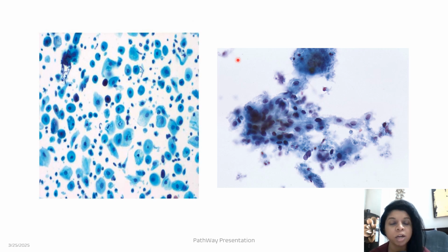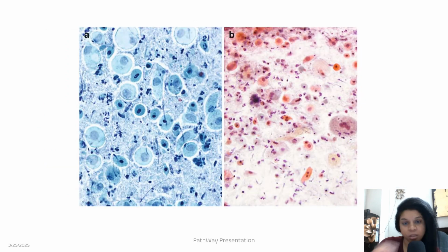And in the background, at times you can get granular debris, which is common in an atrophic smear, because the cell is disintegrating or atrophic. You may confuse this debris for tumor diathesis. Already the parabasal cell layer looks like it has a high NC ratio. Over that, if you see granular debris in the background, in a liquid based cytology, you shouldn't confuse it for tumor diathesis. Look at the age and the clinical history, and then go for the diagnosis.